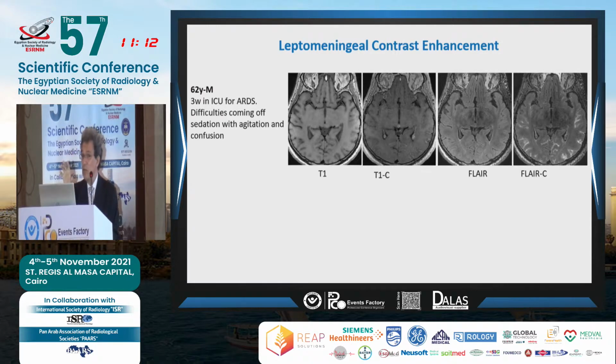Now, they are doing this regularly, all the time. We don't do it, many people don't do it, but we have to think whether, if we want to see leptomeningeal enhancement, that's the way to do it, namely to do a FLAIR sequence after contrast administration. So it was in their hand, and this is mainly coming from the French group, quite frequent.